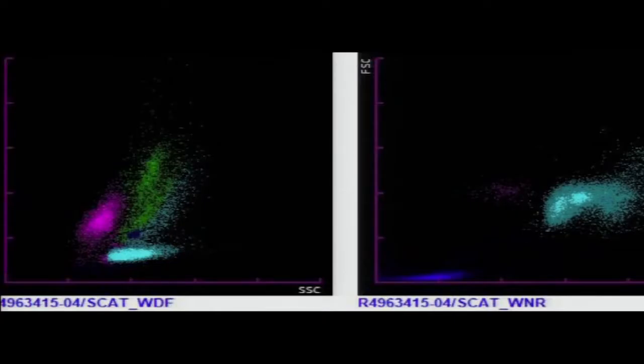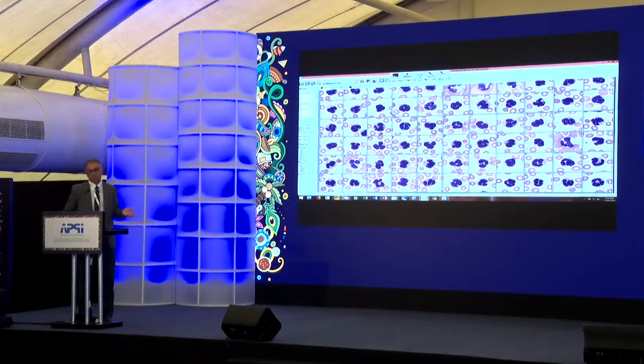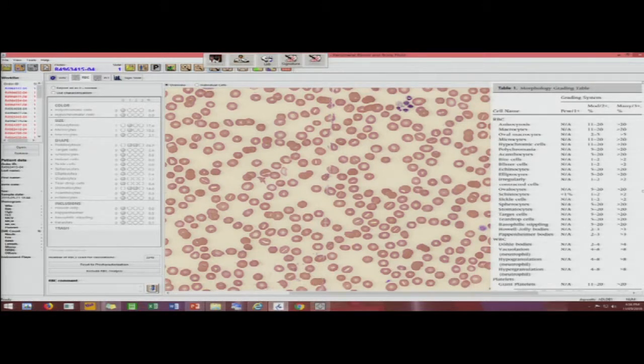I am a bit concerned when the scatter becomes hazy — when there is no separation of cells in a 76-year-old with anemia and thrombocytopenia. Do the cells look good? Dysplastic. We call this myelodysplastic syndrome and it has gone for cytogenetics. The same case incidentally had stomatocytes, and my colleague Dr. Pradeep tells me that he gets to see stomatocytes in MDS. Not every case of MDS has stomatocytes, or every case of stomatocytosis is MDS, but he has seen a relationship — stomatocytes were 14 percent in this case. And there is a cell in that same screen that does not look good.